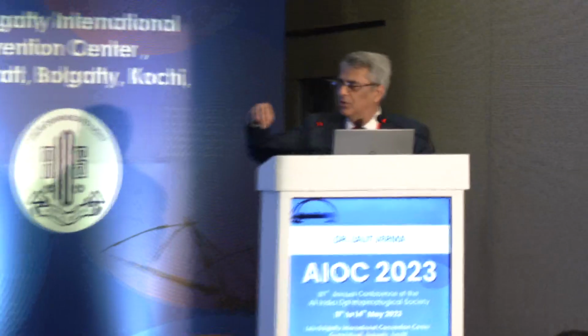So identifying pre-operatively and then changing the technique, I think, is a good way. I really appreciate your video. Absolutely, because idiopathic ERM is a different thing than all these secondary membranes. So you can't keep pulling the membrane without paying attention. Your eye always has to be on the retina. And actually, with macular holes with epiretinal proliferation, you can invert that tissue inside the hole rather than trimming it also. So, what is your threshold of operating VMT?